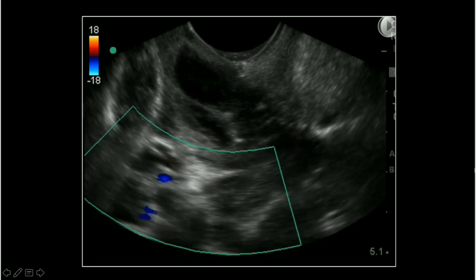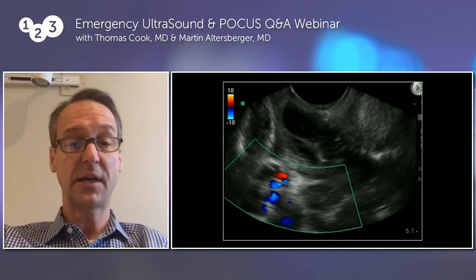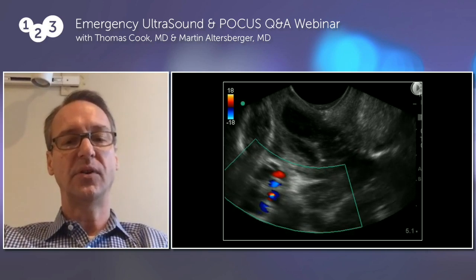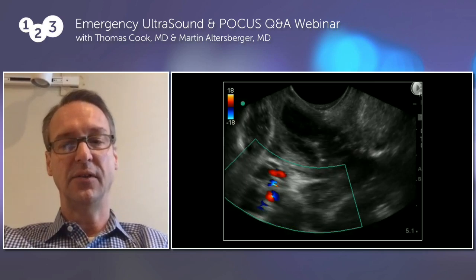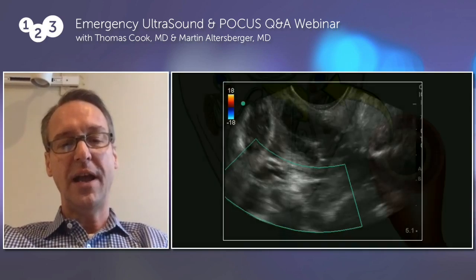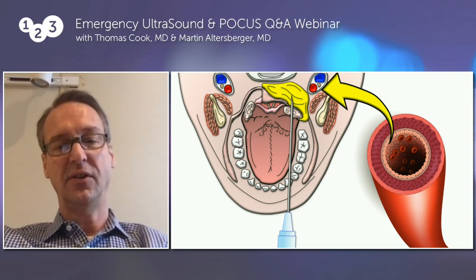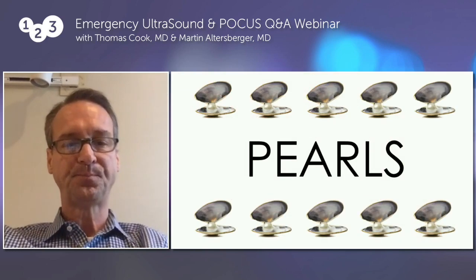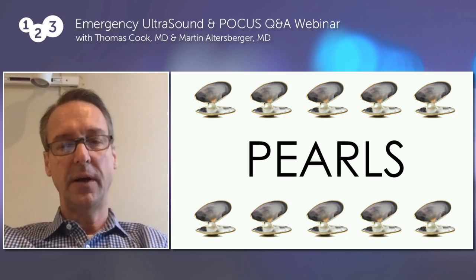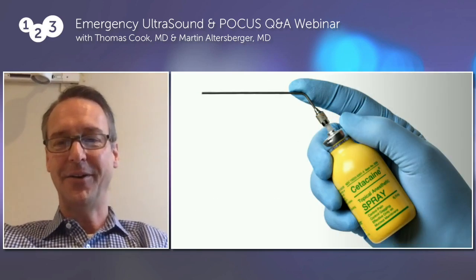So I have to figure out a way to keep the needle from going too deep. The patient could move suddenly. You might slip yourself. You just don't want to drive that needle past the abscess and get into a lot of trouble. So we have to come up with a strategy, and we're going to show you exactly how to do that so you don't put that needle through the abscess and right into the carotid artery. So if you go ahead and advance that slide for me, we'll give you these very important pearls. This is a lifetime of experience on how to avoid trouble.